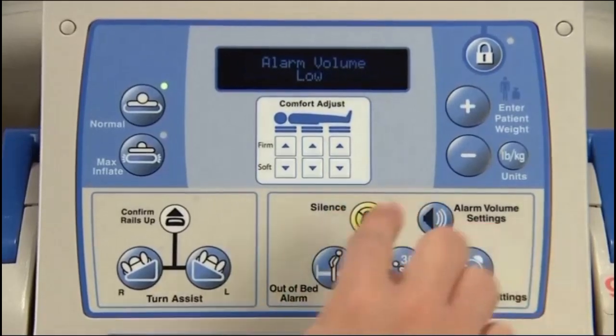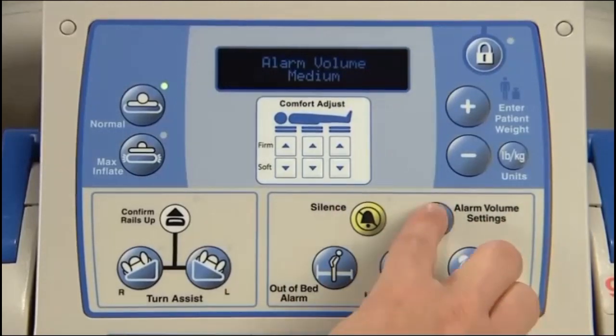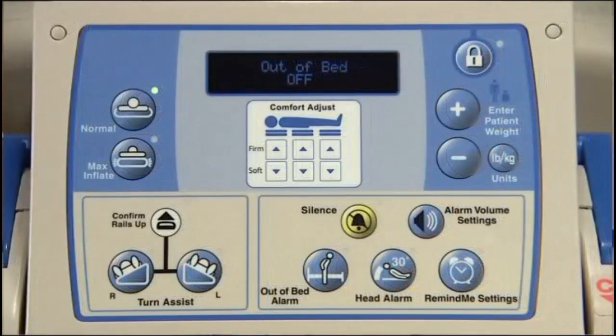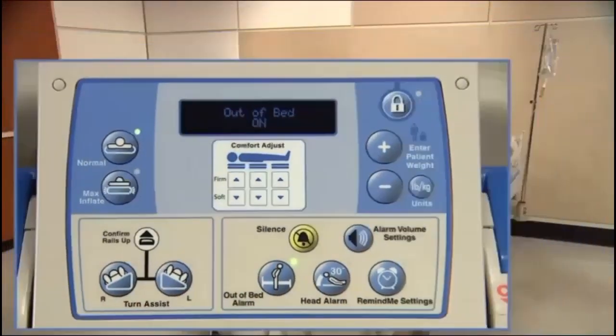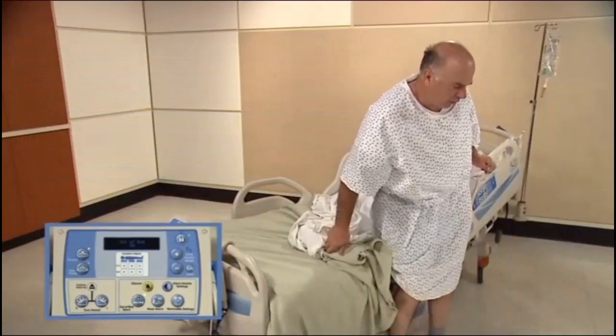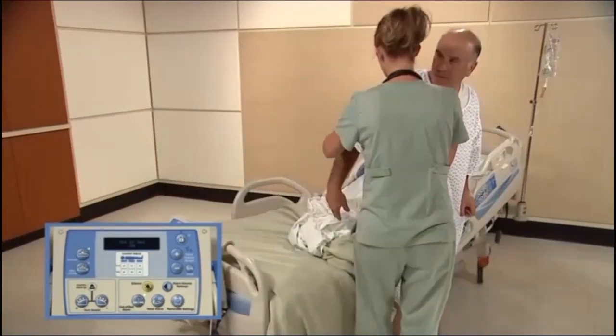Volume is adjusted to one of 3 possible volume settings. The default alarm volume is set on high, but can be adjusted as needed. The next button is the out-of-bed alarm, which will trigger when the patient tries to exit the bed. The caregiver can then come to the assistance of the patient when alerted to the patient's activity.